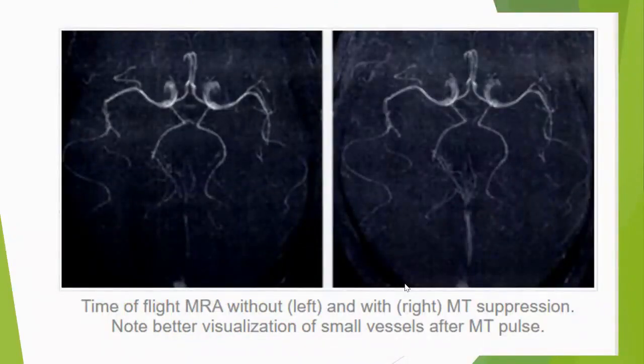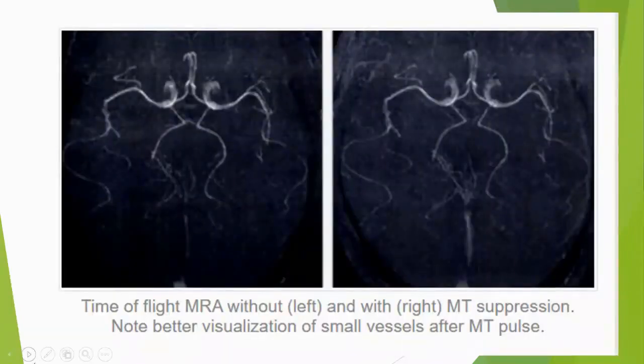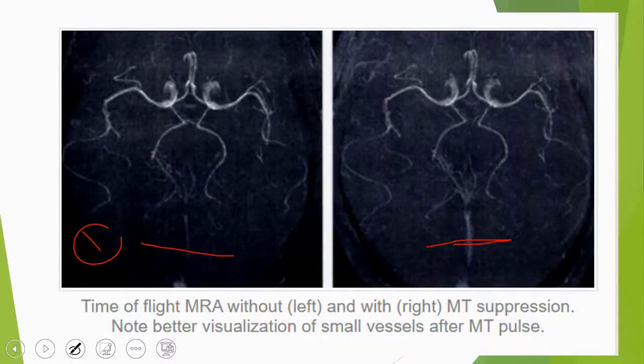which of these two images is better, doctors? Is this one, the cerebral angiography, or is this one better? It's definitely better because there is good resolution and very good contrast between the cerebral arteries and the background. The background signal has experienced saturation and suppression, resulting in high contrast, so the resolution is better.